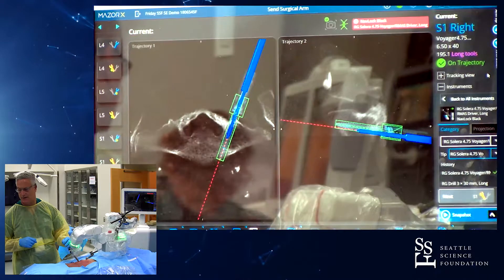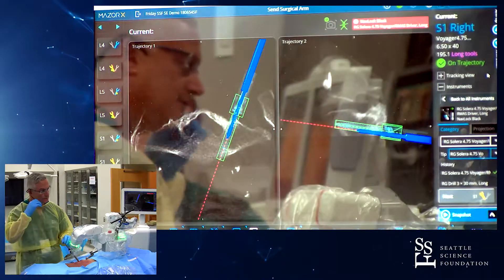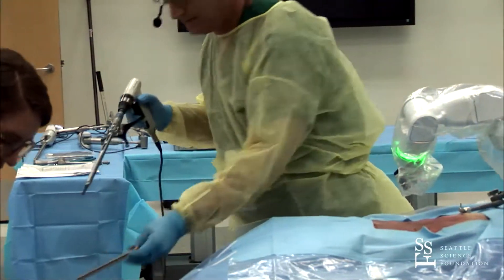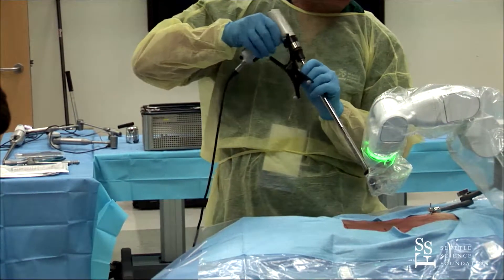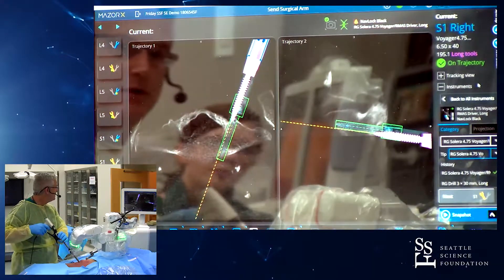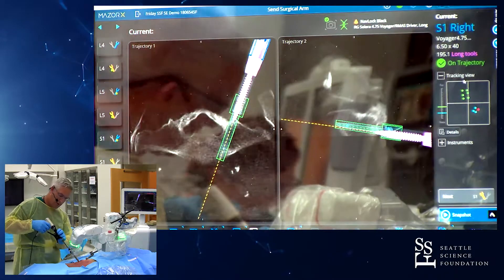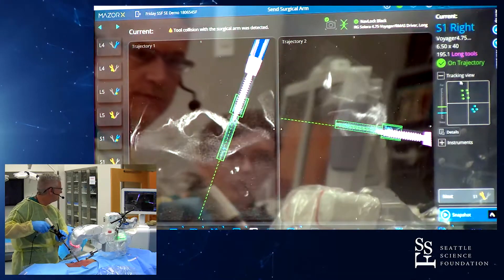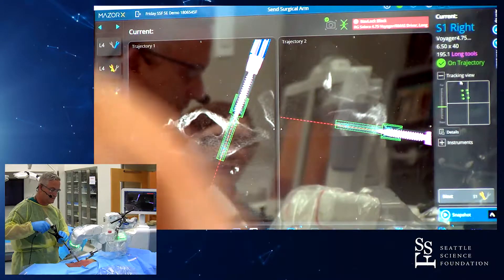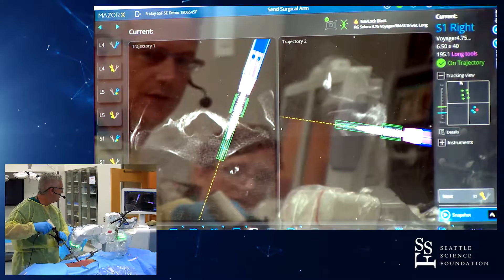Using image guidance and the arm, I can place the screw without the need for a K-wire. That's the safety feature — the NAVLOC is in the arm. So that was just a warning that our NAVLOC was going to hit the arm with the screw placement.